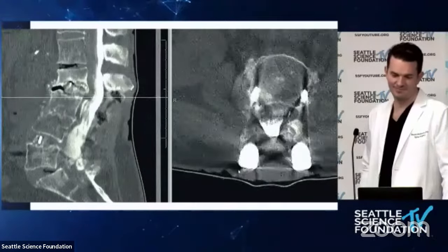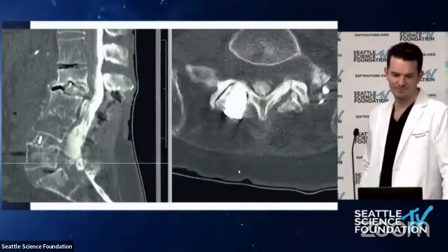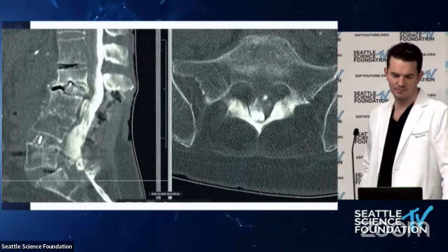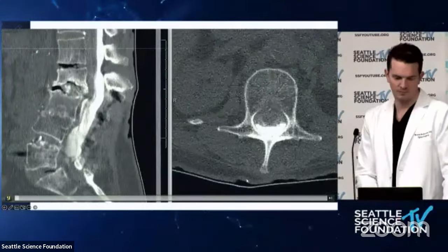Yes, she has a hyperextension isthmic spondylolisthesis with a grade 1 anterolisthesis. Very, very good. And she has an L5 root impingement. You can't see it very well, but there's a repair tissue that has kind of obstructed her L5 roots. Yeah, so I'm always suspicious when you see a listhesis at L5-S1 to verify if they have a spondylolysis. And unfortunately, it seems like it gets missed quite a bit. And then people end up doing different operations that don't really address the underlying pathology.